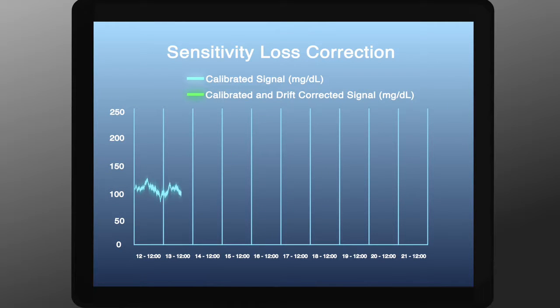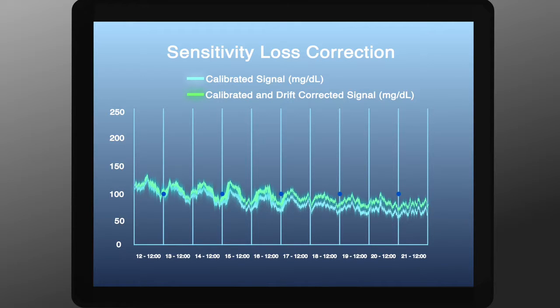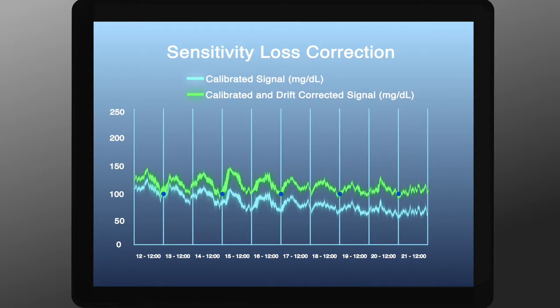Single-point calibrations help account for non-physiologic changes in the baseline glucose value, such as sensor drift due to enzyme instability or fibrin and tissue growth. DSI software has the ability to correct such variations and automatically calibrate the signal.